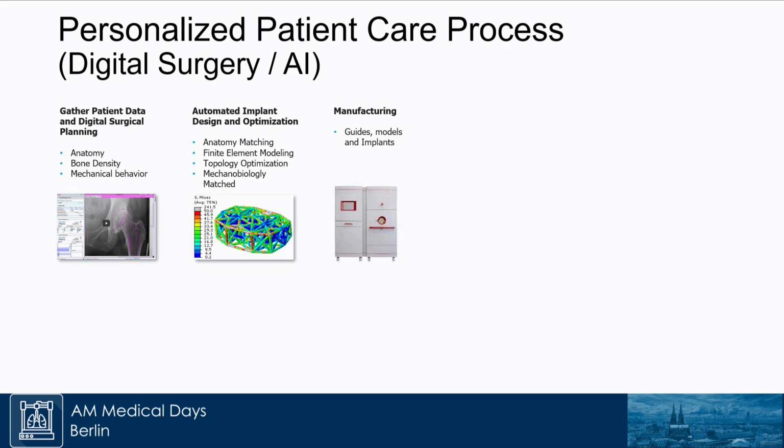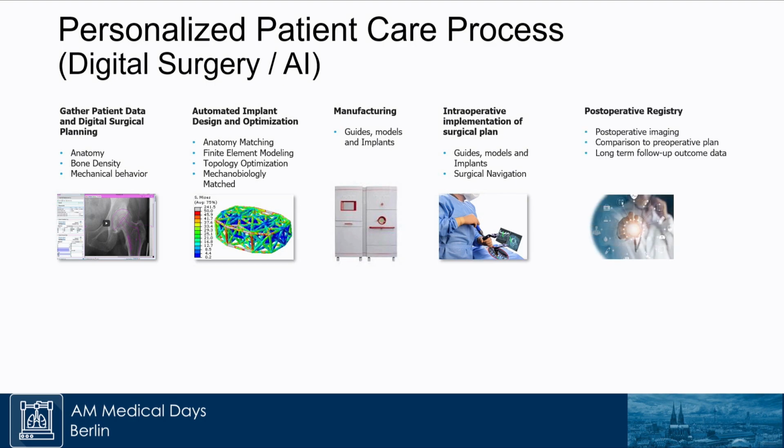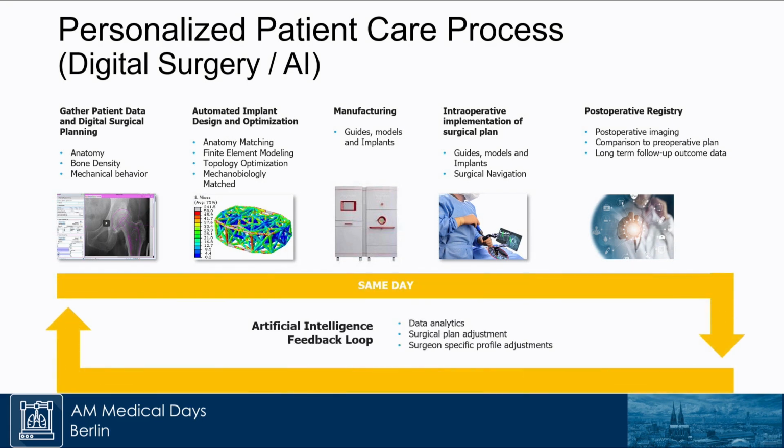Obviously, 3D printing itself is not as much of a challenge as some of the other post-treatment processes. So you don't want to bring the HIPing to the hospital. That's going to be a recipe for a catastrophe if things go out of control. And then we have the surgical automation tools such as robotics, and we use that along with the instruments to have a very good procedure. So the question is, is it possible that we could do a same-day surgery if we bring everything in-house to the hospital and we have all the resources? That's a question which has to be answered.